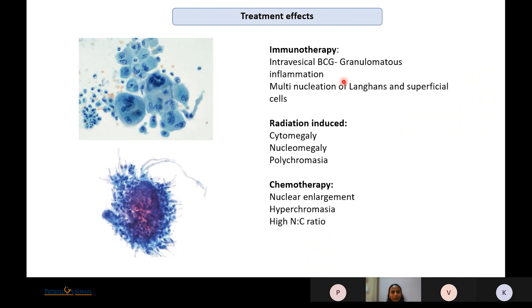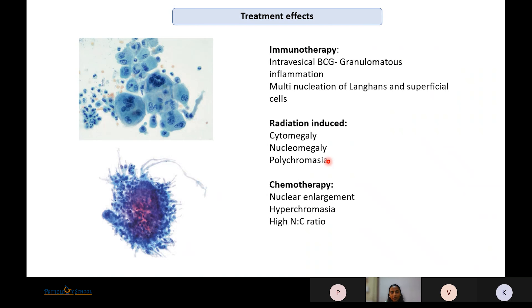Treatment effects: if there has been intravesical BCG administration, there can be granulomatous inflammation with granulomas and Langhan's-type giant cells. This multinucleation should not be confused with the multinucleation of superficial cells, which have pale powdery chromatin with nucleation located at one pole. Radiation-induced changes include cytomegaly, nucleomegaly, and polychromasia without increased NC ratio, whereas chemotherapy changes show increased NC ratio with nuclear enlargement and hyperchromasia.